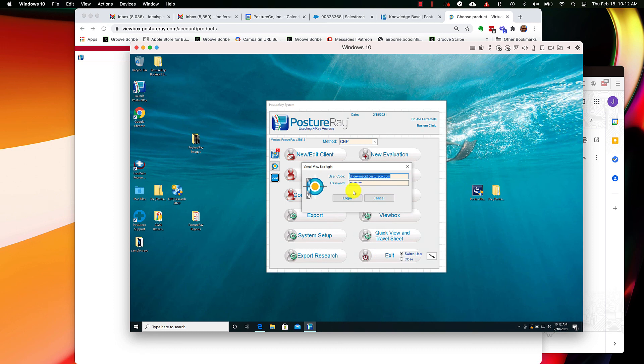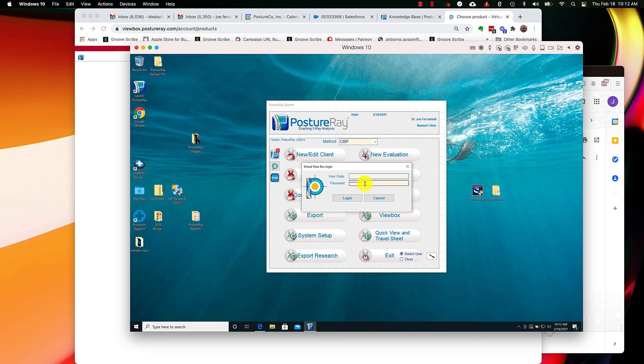When you start Posture, just ignore this email address here. What you're going to do is you're going to get this little pop-up. Make sure your email's in there and put in your new updated password, otherwise you're not going to be able to log in. Make sure that you go ahead and do that. That's very, very important.